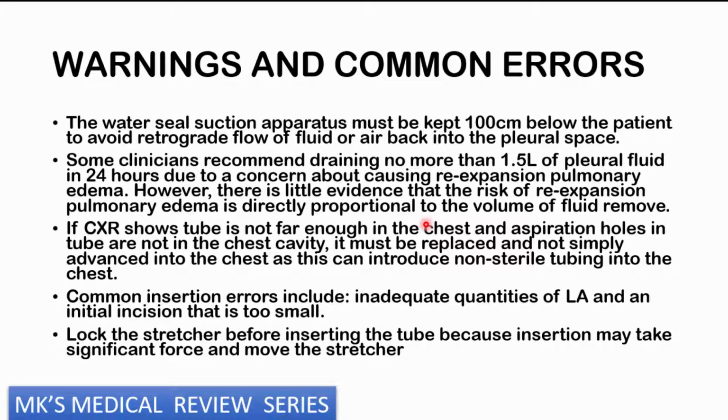Then some warnings and common errors that are often noted with ICDs. So the water seal suction apparatus must be kept 100 centimeters below the patient to avoid, of course, retrograde flow or even siphoning back of the air into the pleural space. And some clinicians actually recommend that you shouldn't drain more than 1.5 liters of the pleural fluid in 24 hours because there is this concern that the patient may have what is referred to as re-expansion pulmonary edema. Even though there is very little evidence that there is a risk of re-expansion pulmonary edema that's going to be proportional to the volume of fluid that is removed, some clinicians still shun away from draining more than 1.5 liters in 24 hours.